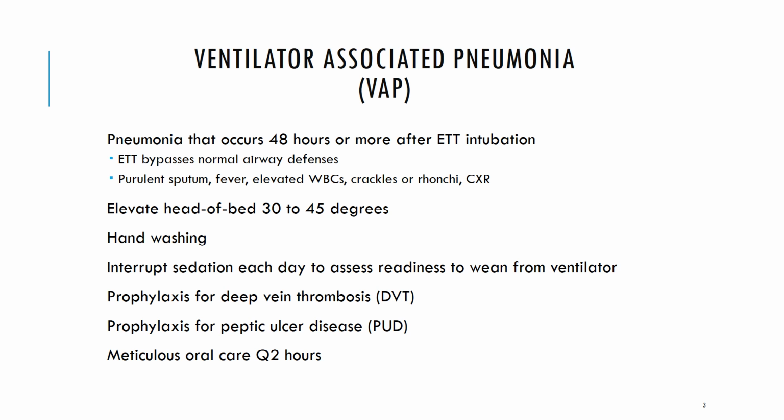And then something you may have heard of already is called the VAPP bundle. This is basically a group or a bundle of interventions that are geared toward a goal. So a VAPP bundle includes specific interventions to reduce ventilator-associated pneumonia. Most commonly, this includes elevating the head of the bed to either 30 or 45 degrees, providing the patient a daily break from sedation, and that will increase their neurological stimulation, possibly exercise their breathing muscles.